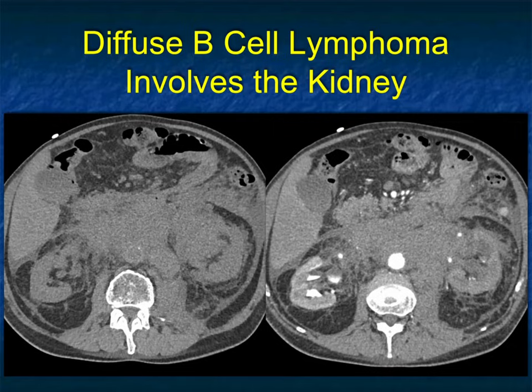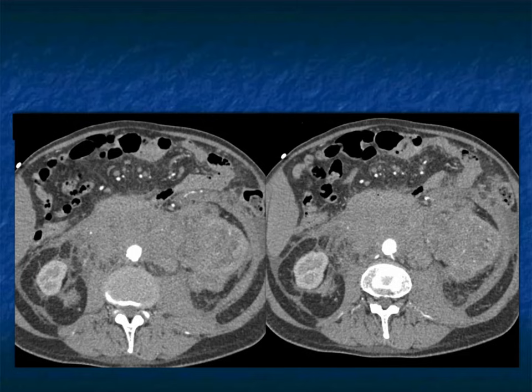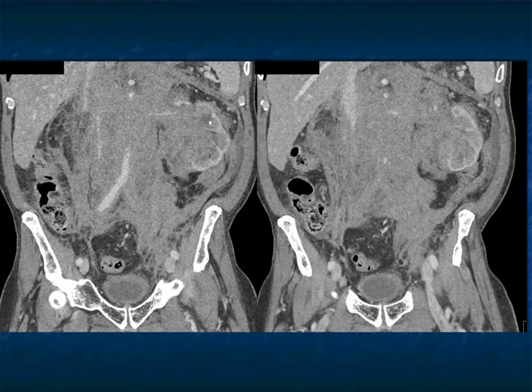Here's an example of lymphoma infiltrating both kidneys with bulky adenopathy in the periaortic region — very characteristic of lymphoma. When you see bulky adenopathy, I'm always thinking about lymphoma regardless of organ involvement. The kidney involvement is the icing on the cake, but the bulky masses alone make me think lymphoma. This case is also a good example of how lymphoma is typically hypovascular — you're not going to see hypervascular lymphoma. If a renal mass shows lots of vascularity, think of something else.